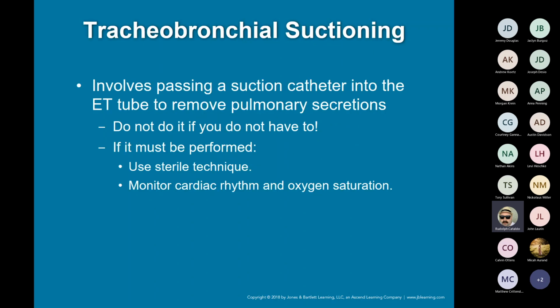In the instance where we have somebody that's intubated and we have to clear the tube, it's as simple as putting a soft suction down the ET tube. You could lower it essentially down to the lower level of their lung if needed. You'll see this a lot in patients that have severe cases of CHF. If you've ever heard of flash edema, some of those patients can have a pink frothy sputum, I think is how it's described. In those instances, you can see that start to come back up the ET tube.